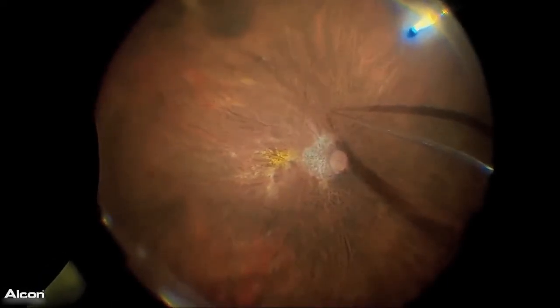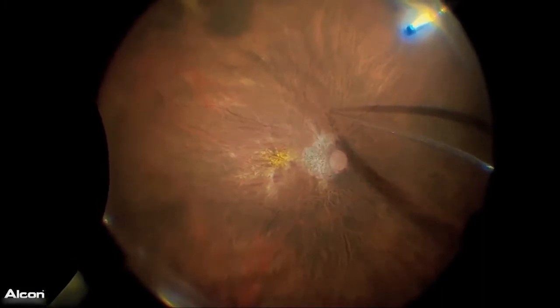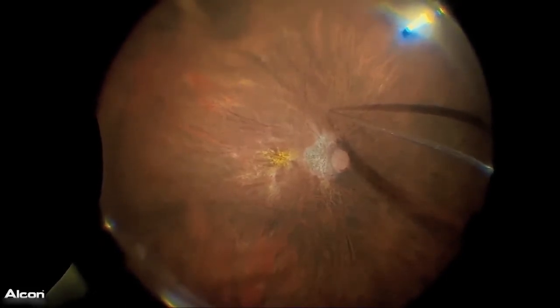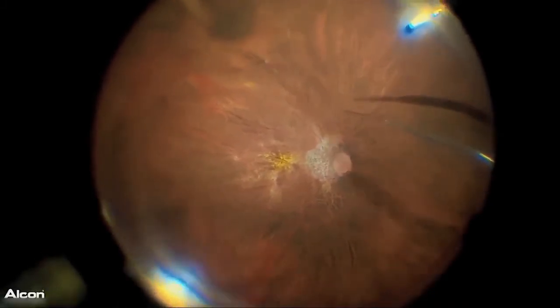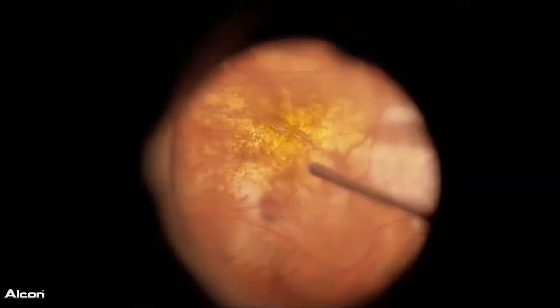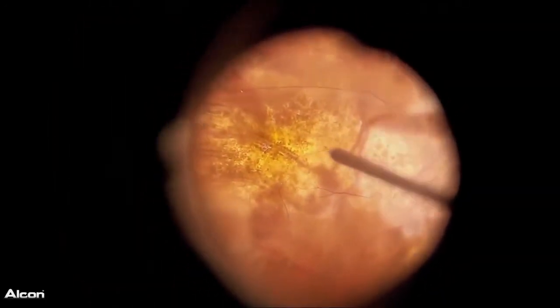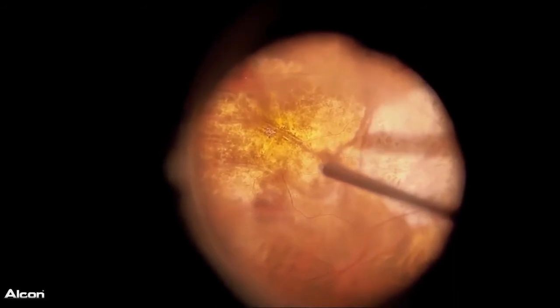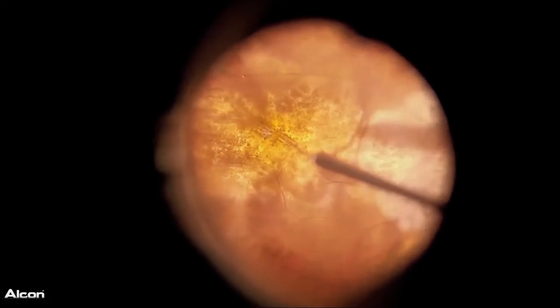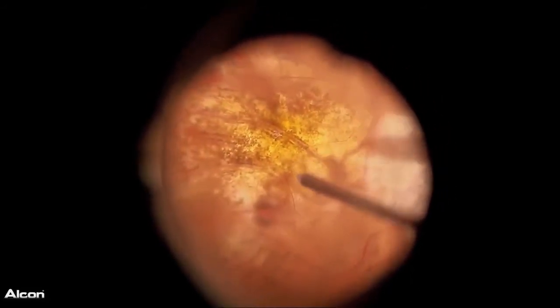This is another case of a large macular hole in highly myopic eyes. I decided to perform autologous central retinal transplantation, because the inverted flap technique, which is a conventional technique to close the macular hole, is very difficult for a large macular hole with a size over about 1,500 micrometers. These are the images from the contact lens with the Ingenuity system.